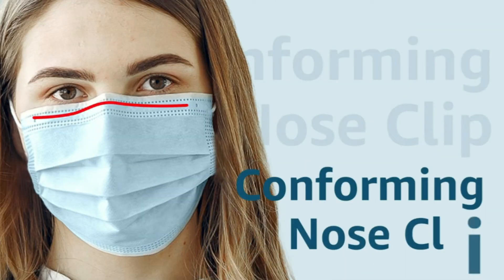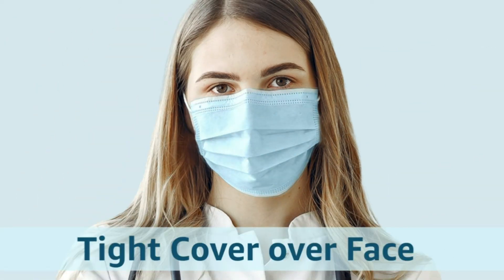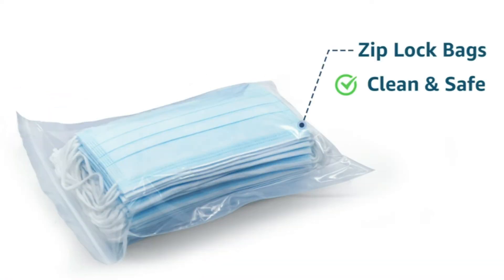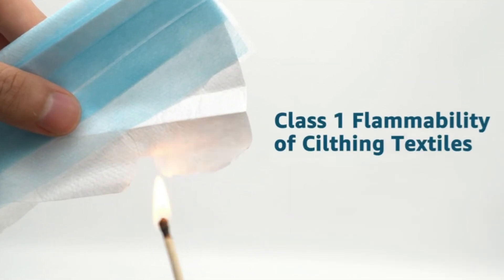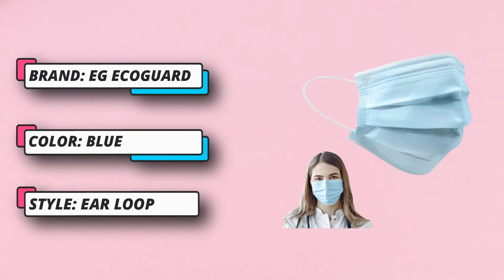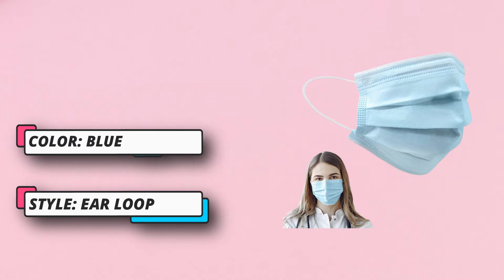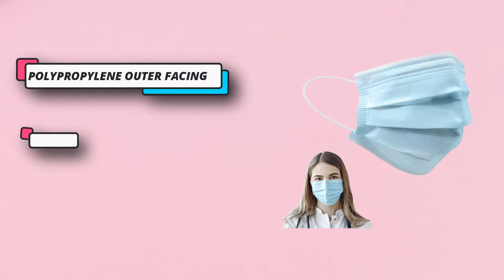It is ideal for patient use and quick application, as it delivers the same level of protection to the wearer if worn correctly or inside out. Level 3 masks offer the highest level of barrier protection, with excellent test performance of liquid barrier at 160 millimeters of mercury, and flame spread. All raw materials sourcing and face mask manufacturing are done in the United States.